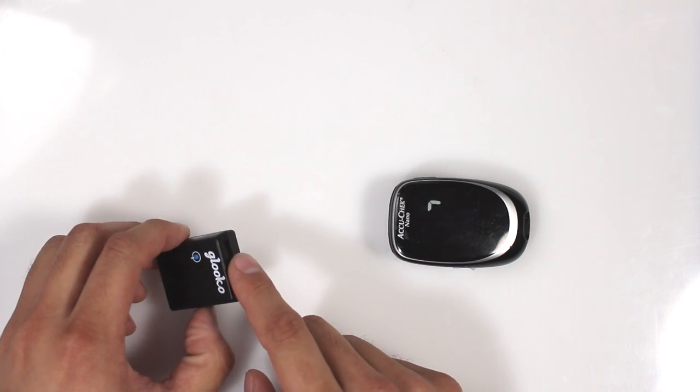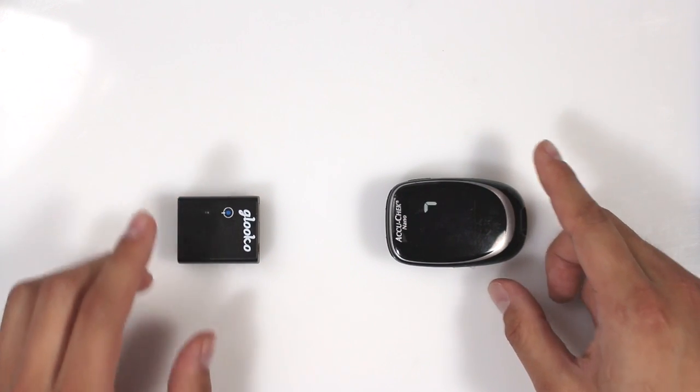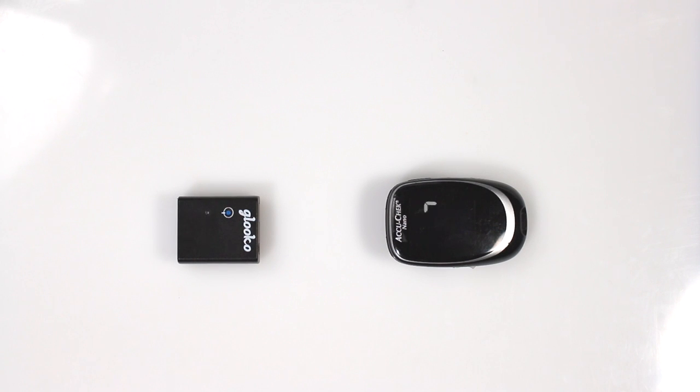Align the IR window at the top of Meter Sync Blue with your meter. Make sure you position the two devices 2-3 inches apart. That's it — you're ready to Sync.